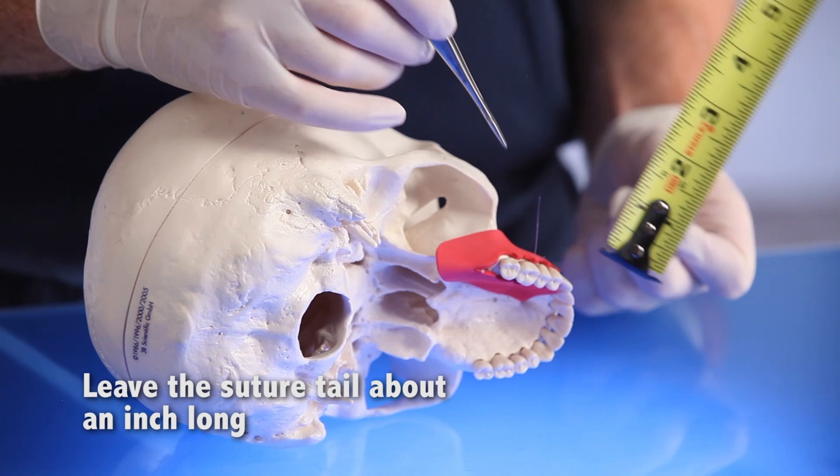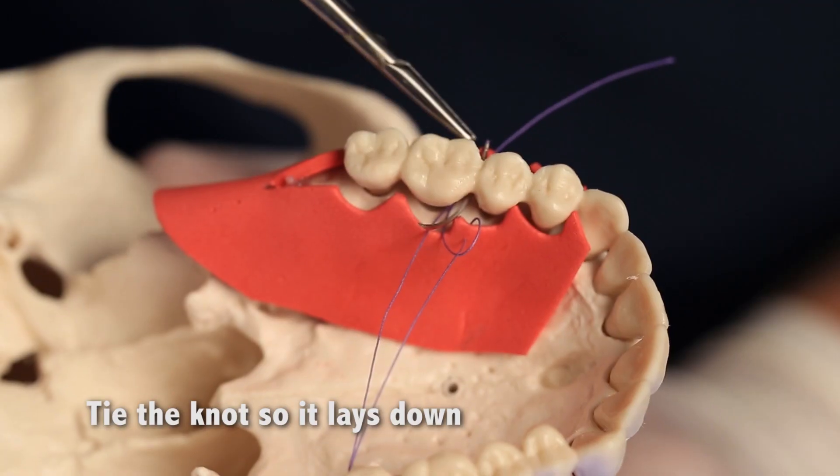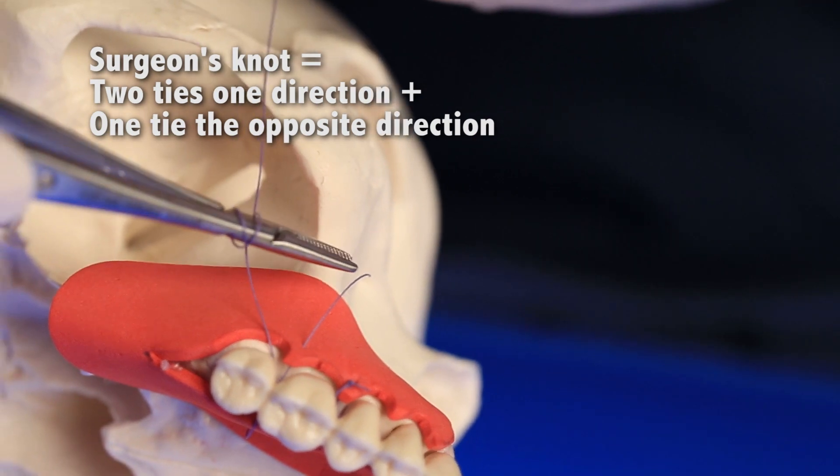Number five, leave the tail of the suture about an inch long. Number six, tie the knot so it lays down. Number seven, use a surgeon's knot: two ties one direction, one tie in the opposite direction.